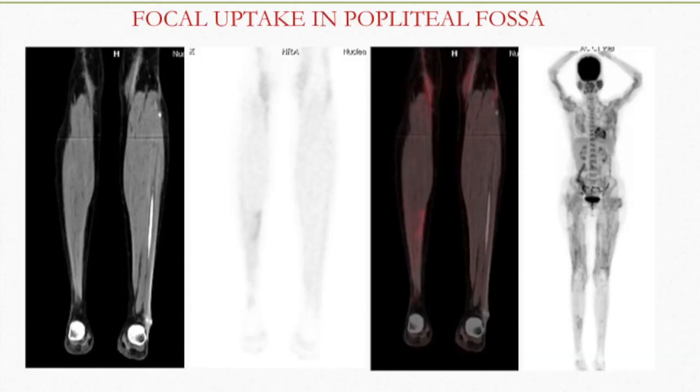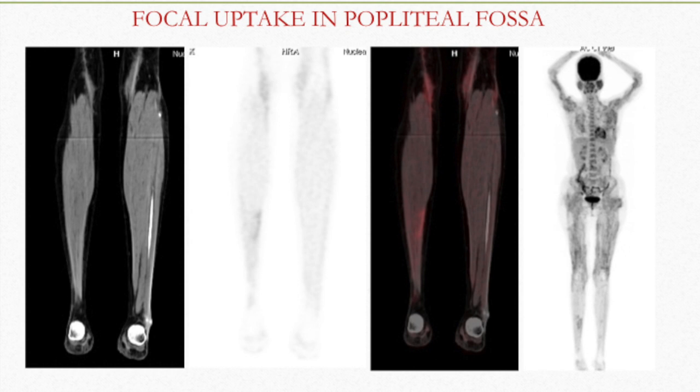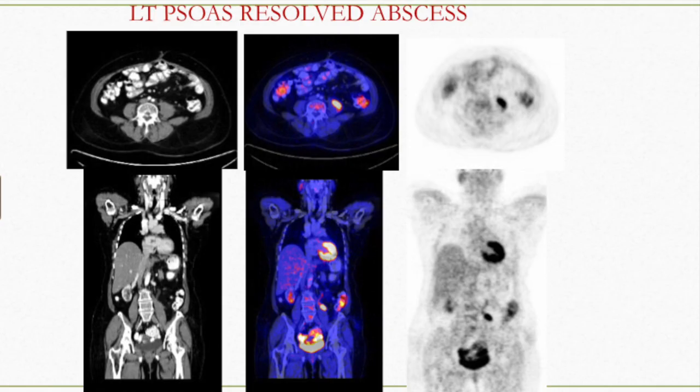There is a focal area in the popliteal fossa showing some inflammation. There are also cases of diffuse myositis bilaterally with increased uptake on the contralateral side that is asymmetric. Another case of parotitis on the left side shows uptake compared to the right side, consistent with parotitis. There is also a case of left psoas abscess tuberculosis — the psoas muscles are asymmetrical, with the left being bulky and showing a focal area of uptake consistent with psoas abscess tuberculosis.